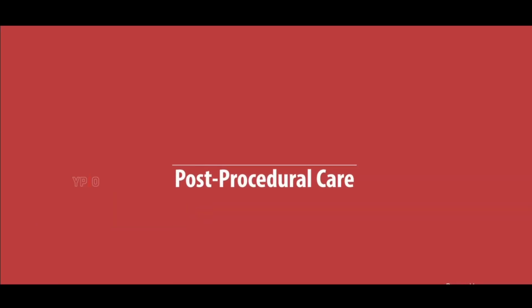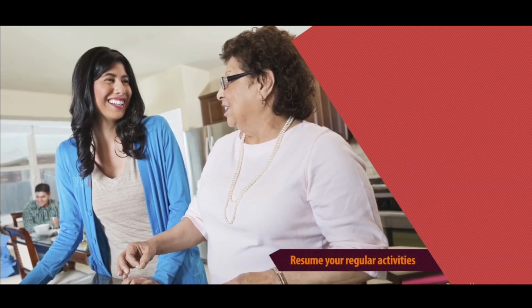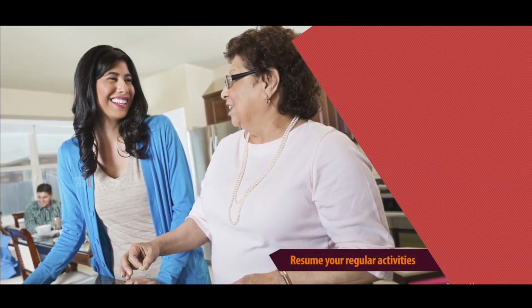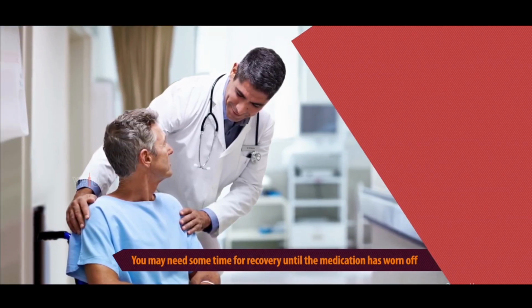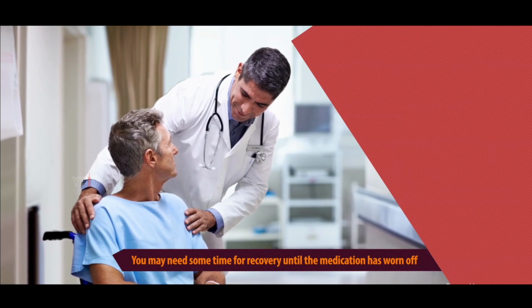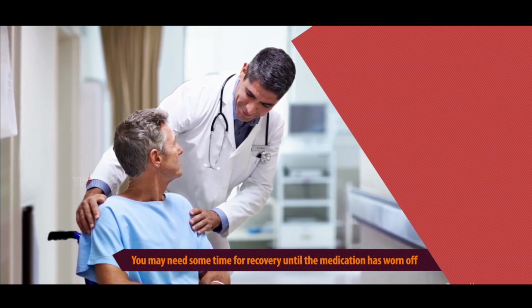Post-procedural care. You can resume your regular activities immediately if you were not sedated. Otherwise, you may need some time for recovery until the medication has worn off, and to check if you have any side effects to the contrast agent.